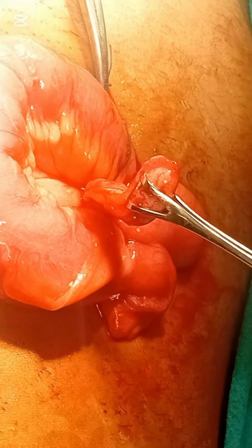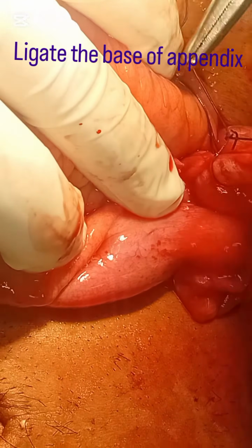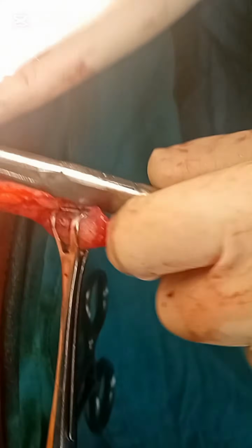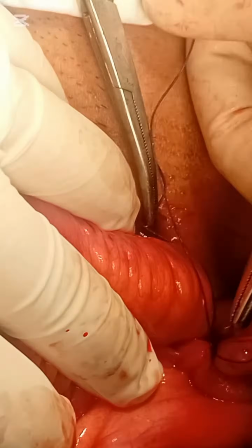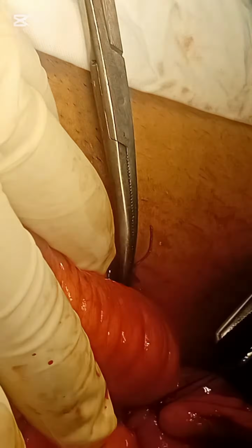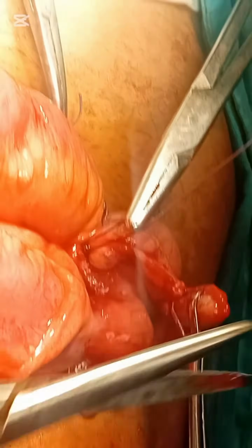Now, ligate the base of the appendix with Vicryl and make it closed perfectly. Just hold the suture for about 5 seconds and apply firm pressure. Make almost 5 to 6 knots and ensure that every knot is tight. Otherwise, during the separation of the appendix, we will see fecal matter coming out from the cecum, because the lumen of the appendix is connected with the cecum.